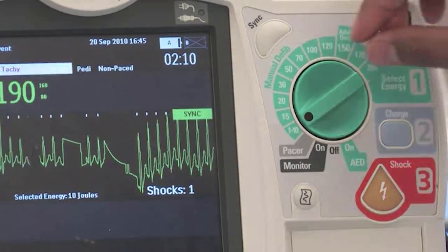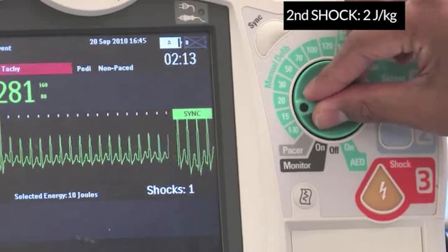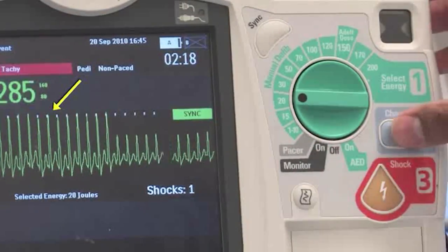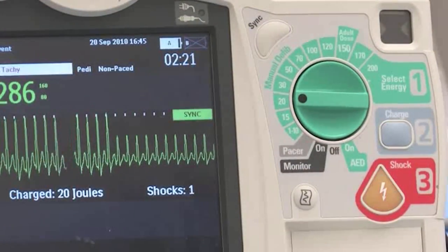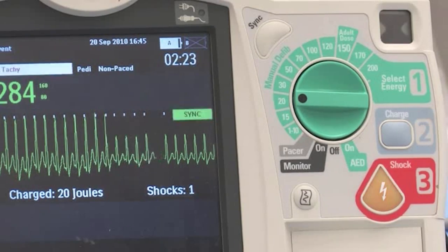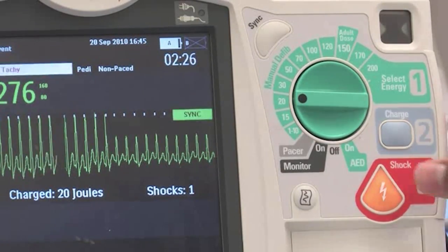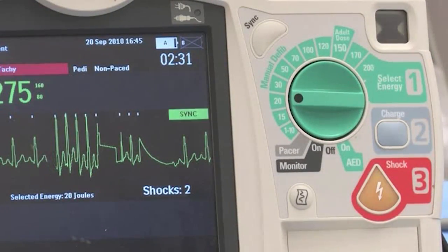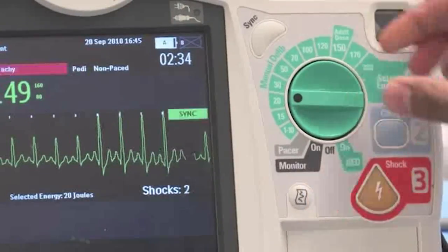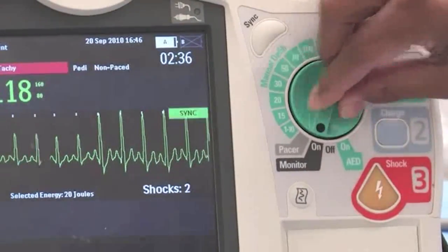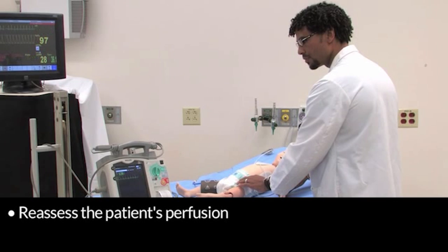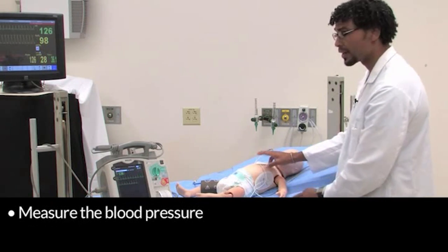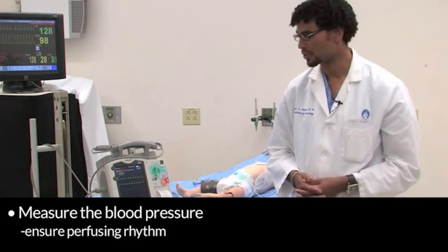Our first shock was unsuccessful, so I immediately go to 2 joules per kilogram. I once again ensure that I am synchronized with the R-wave of the QRS complex. I charge the machine — clear, I'm clear, you're clear, we're all clear — and deliver a shock. We have a restoration of what appears to be sinus rhythm. I reassess the patient's perfusion — I can feel strong pulses. We cycle the blood pressure and make sure that this is a perfusing rhythm.